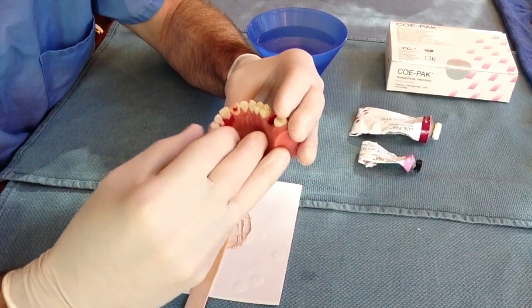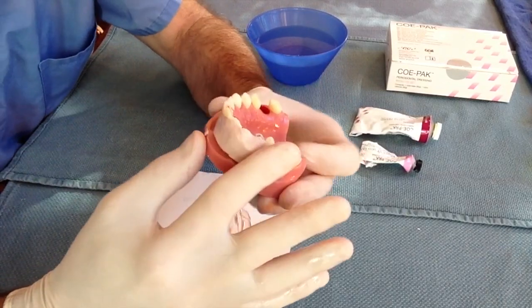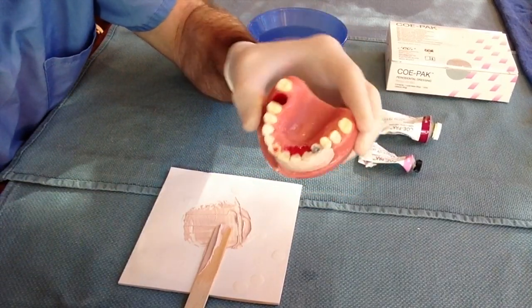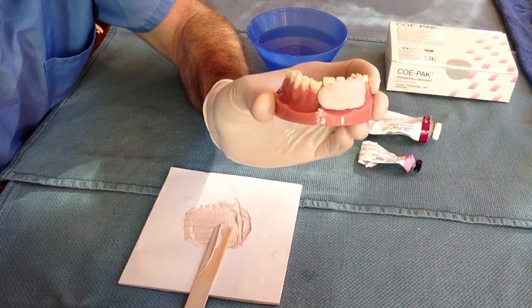You can apply the Copac to both the facial and oral surfaces of the teeth if necessary to stabilize the tooth. In my experience, if you really work the paste into the interproximal spaces of the teeth, you usually can get adequate stabilization by just applying to the facial surface.